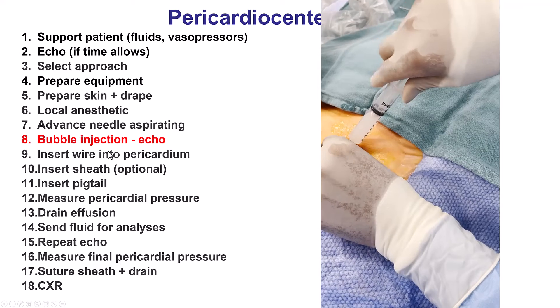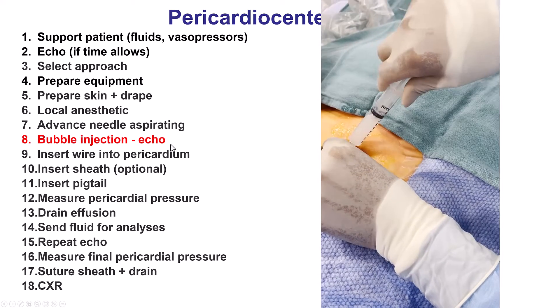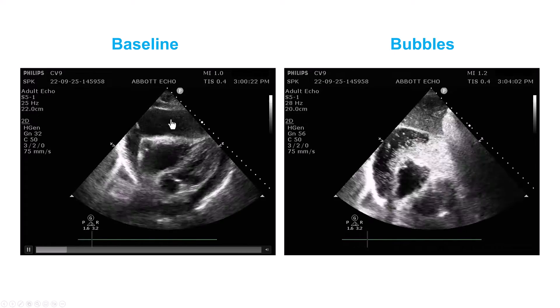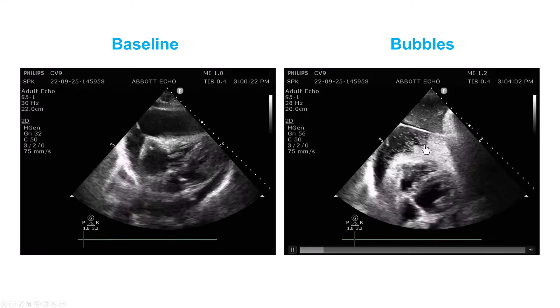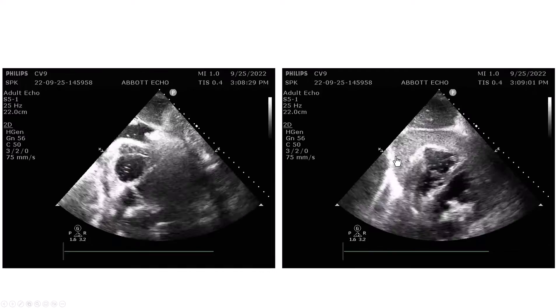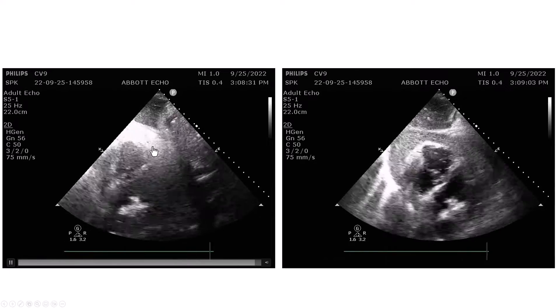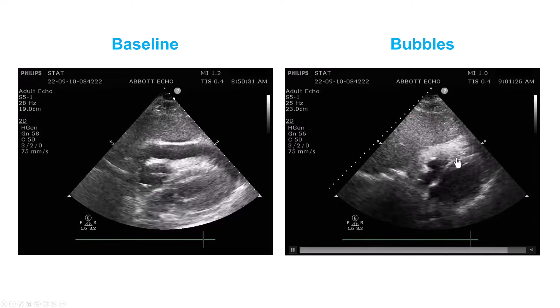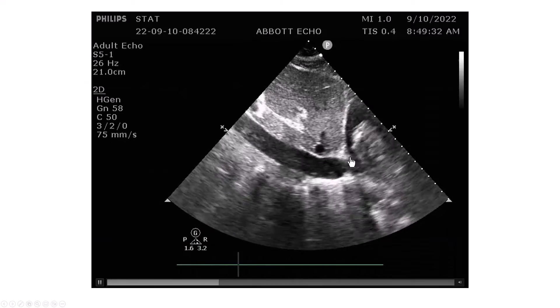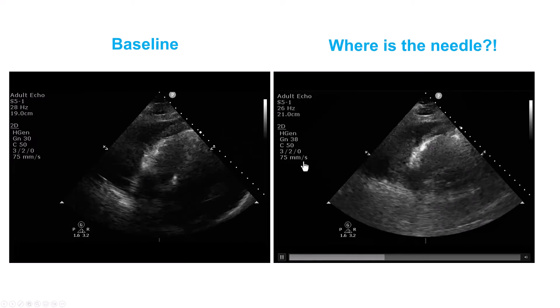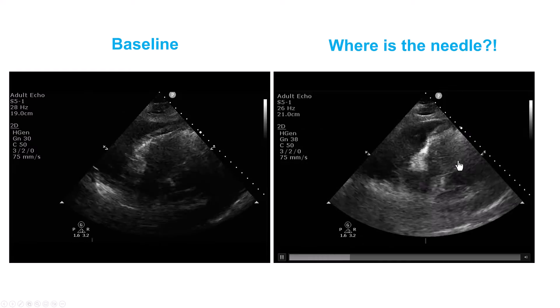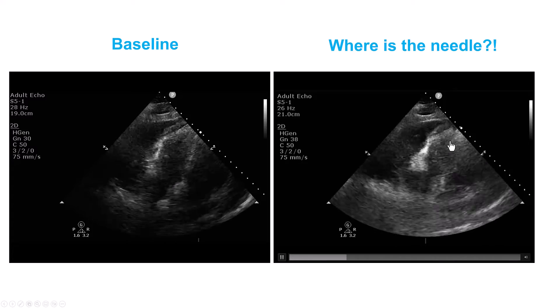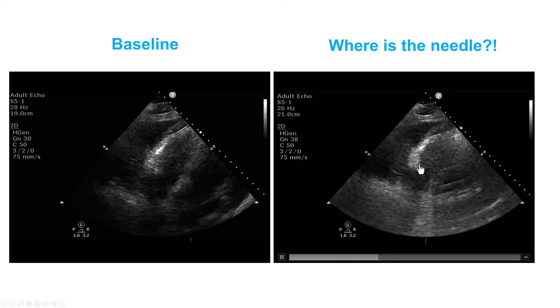Step number eight is to inject the bubbles. Looking under echo, we can see where the bubbles are going. When correct, the bubbles are clearly visible inside the pericardial space. The IVC may also appear dilated in cases of tamponade. If bubbles appear in the right ventricle rather than the pericardial space, the needle is in the wrong location and the wire and pigtail should not be advanced.